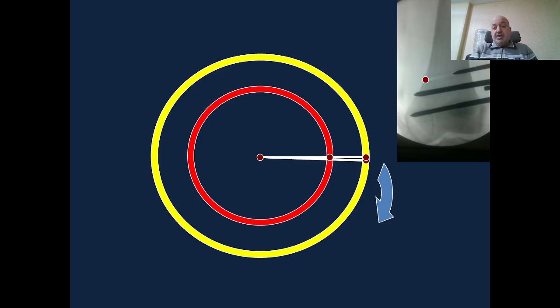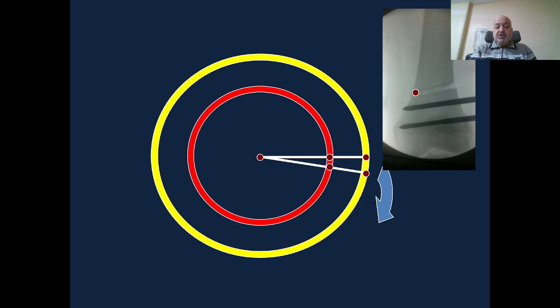our construct. With this drawing and this graph, we can imagine together how the osteotomy will open and how the correction is done. So we do what's called a circular distraction. The center of the deformity is the center of the CORA, or the virtual hinge. We do the osteotomy. Please imagine the red circle and the yellow circle.